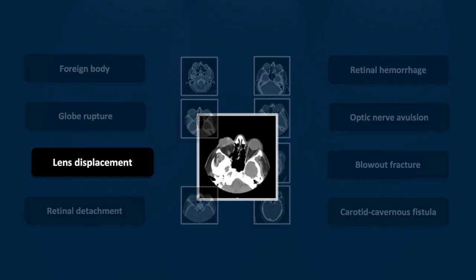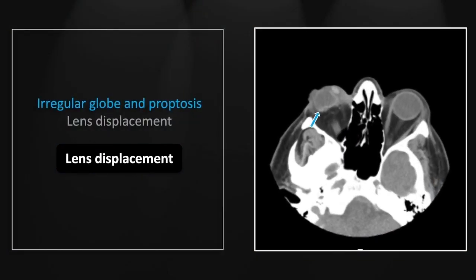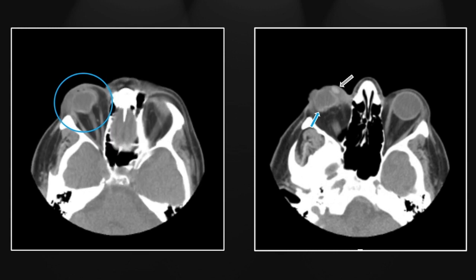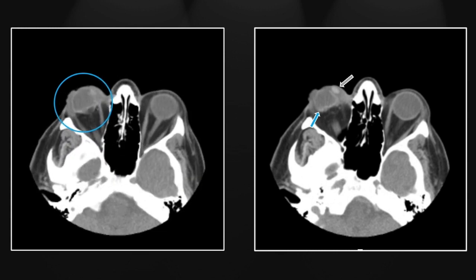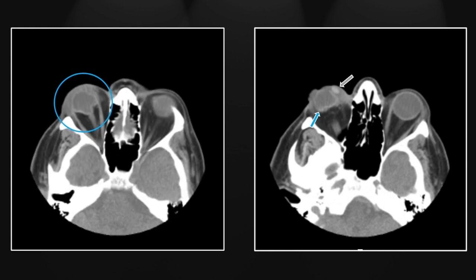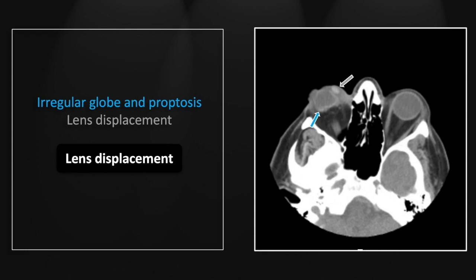Next, an unusual lens displacement. The globe is again irregular and quite clearly ruptured, also somewhat proptotic. Here the lens is displaced externally, lying on the medial anterior aspect of the globe — an unusual case where the lens has flipped outward rather than being displaced posteriorly. Note the irregularity of the globe contour and that displaced lens. That is a case of lens displacement accompanying globe rupture.